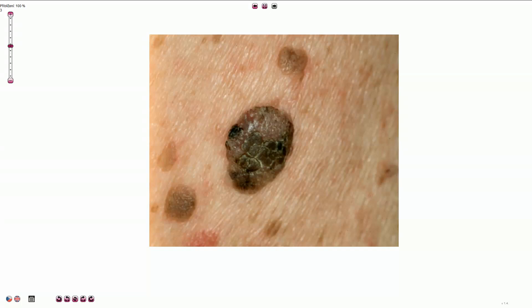In this video I would like to describe one of the most common skin lesions called seborrheic keratosis, including various subtypes.